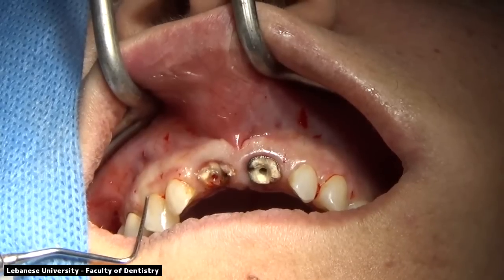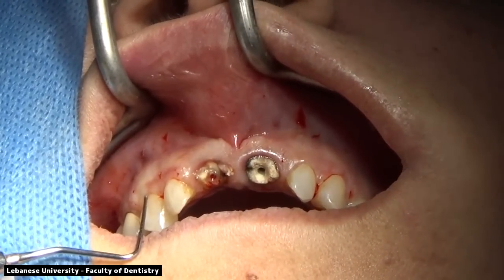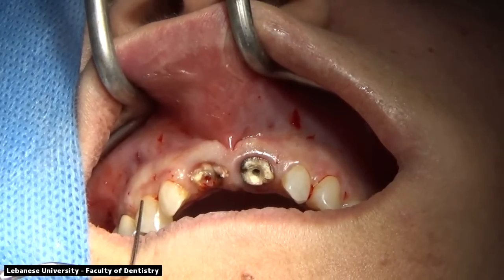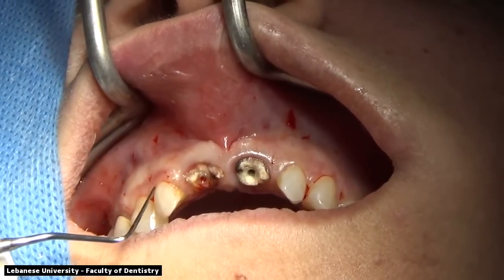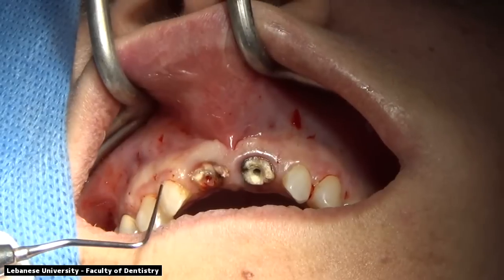central and lateral incisors. We do have some sulcus depth, so we are measuring right now to sound where the bone is and where the cementoenamel junction is so that we know how much soft tissue we're going to be removing and if we have remaining biologic width without doing a crown lengthening procedure. If a gingivectomy by itself will be sufficient for this case.